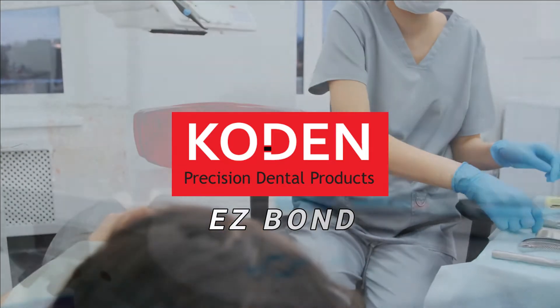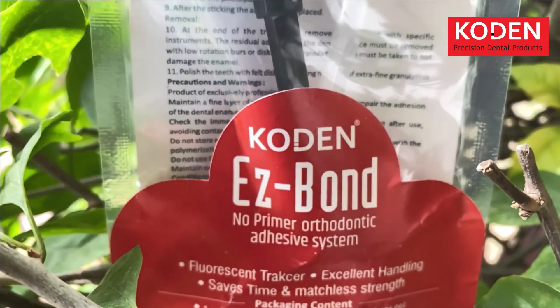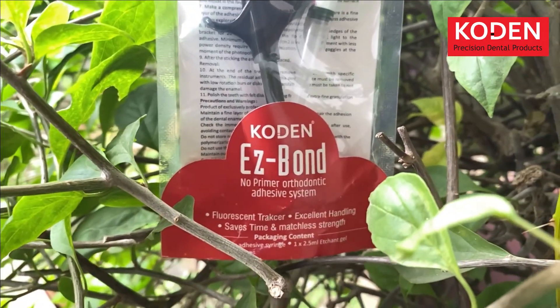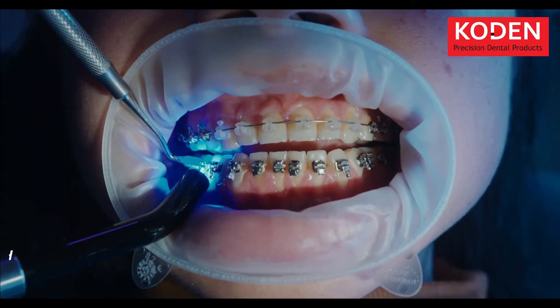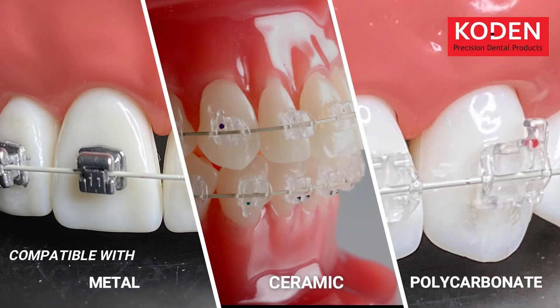Codin brings you a single product for all bonding treatments: Easy Bond. This is not just another bonding material. Easy Bond is a light-cure orthodontic adhesive that is compatible with metal, ceramic, and polycarbonate brackets.